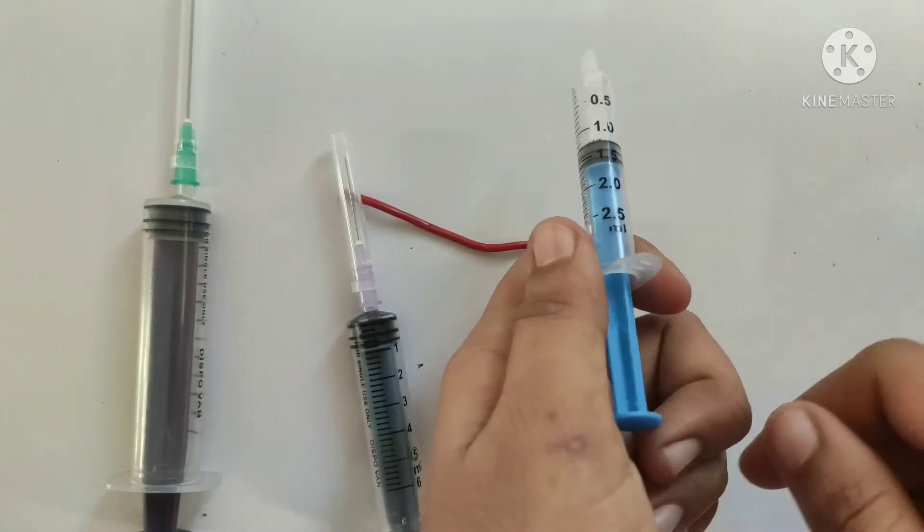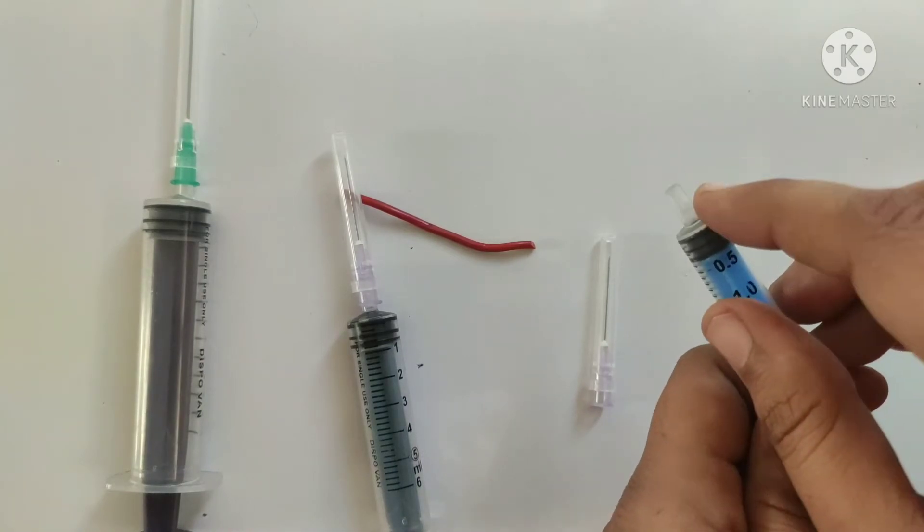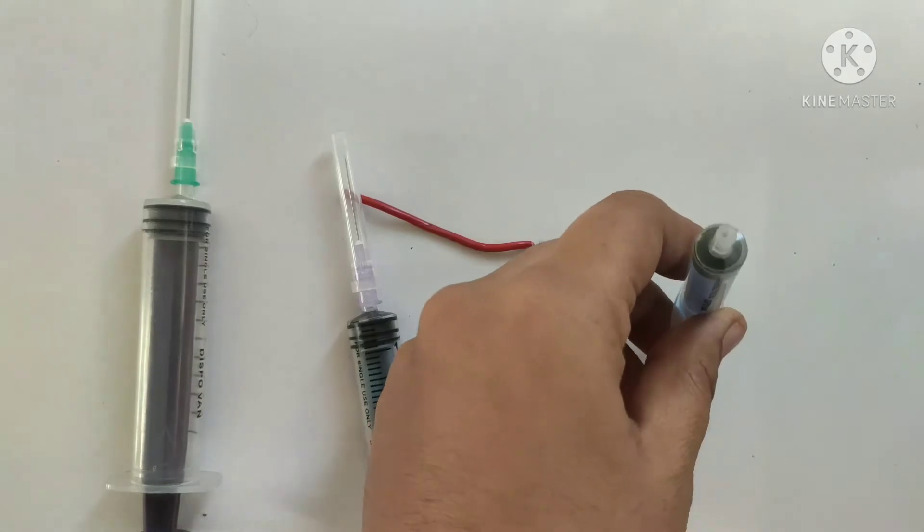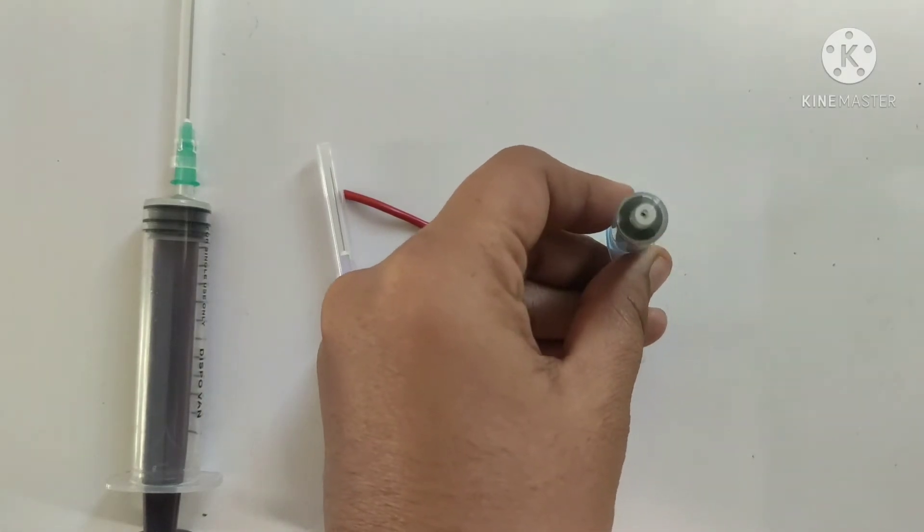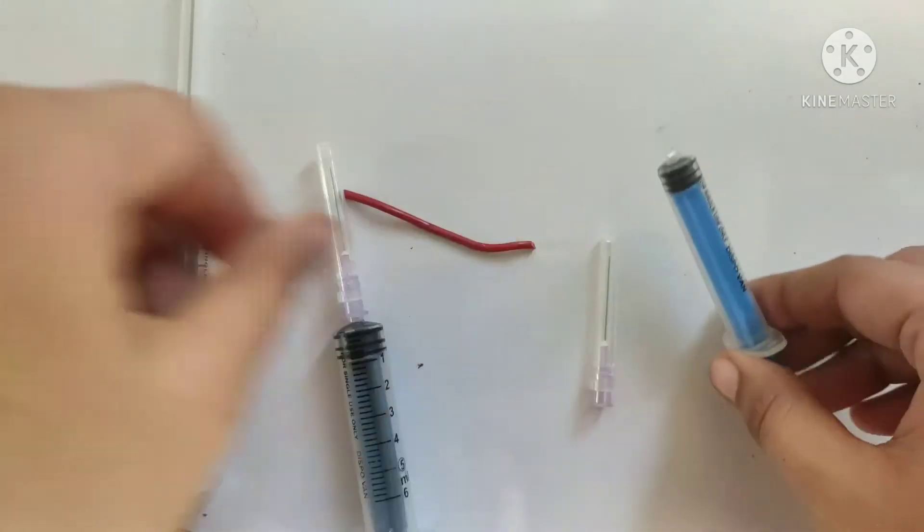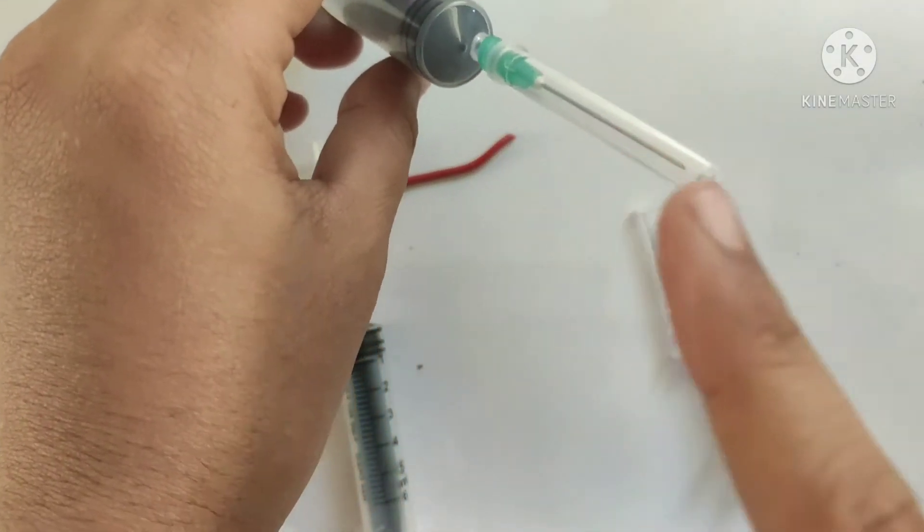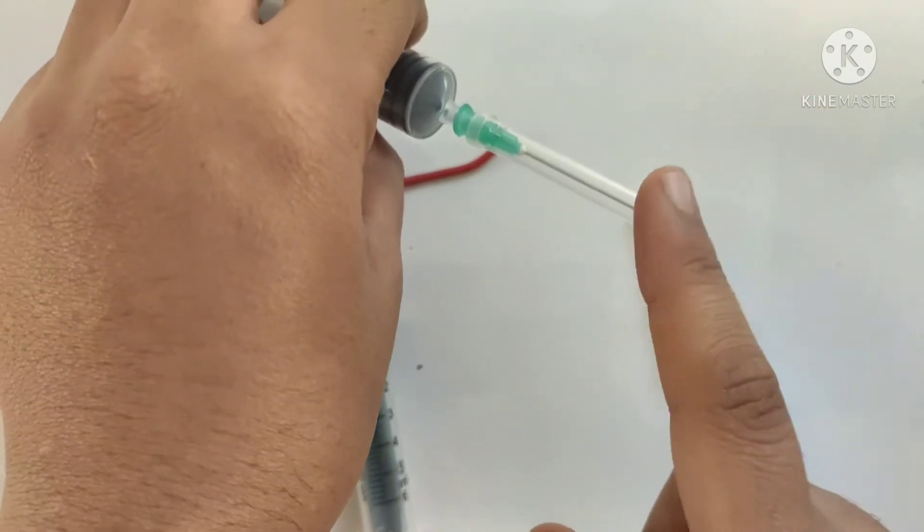The third part is known as nozzle or tip, where our needle is inserted. We can see that in this syringe, this nozzle is located centrally. But in some syringes, this nozzle will be located in periphery, as we can see in this one. It is used for intravenous injection.